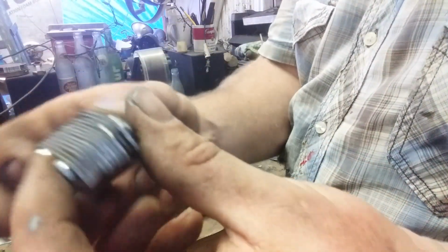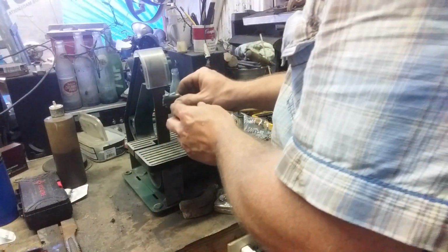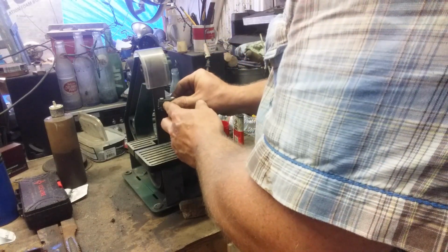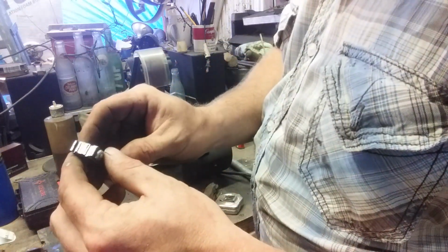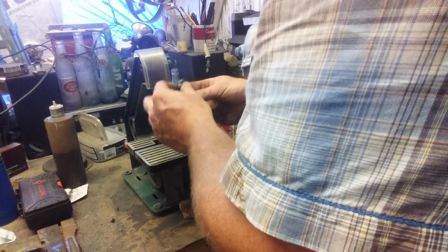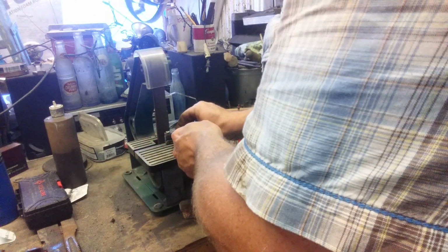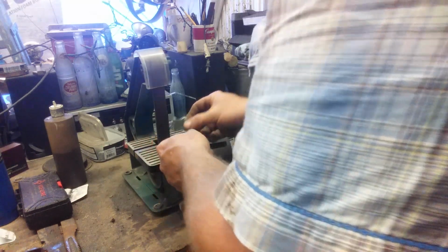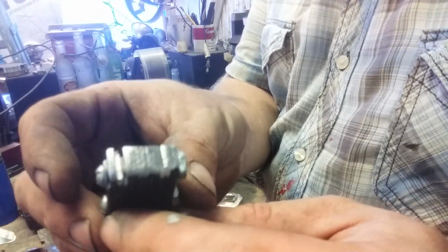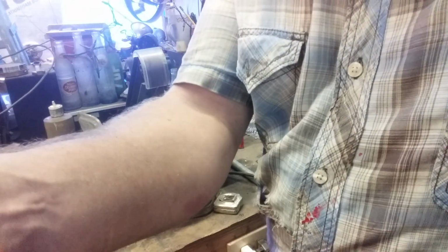Alright, they've been bolted together. Those holes are pretty much perfect. Now I got to round this out. It will get hot, so I'm going to go easy at it. It's already warming up, as you can see that I'm grinding it together. I'm going to have to let it cool several times. So I will get that done and get back with you for a little mock assembly. We'll see what we got. See you in a minute.